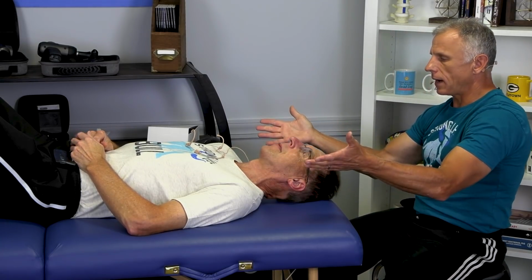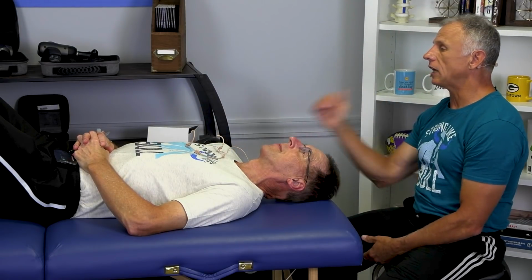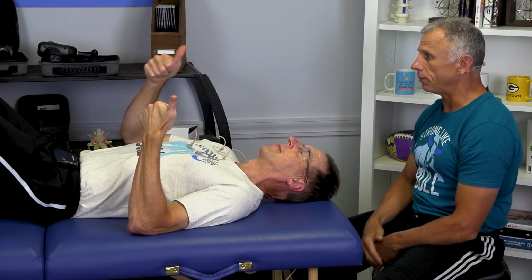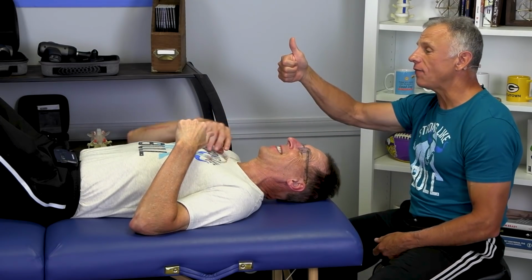Does it still feel good, Bob? Okay. Did the pain or the numbness feelings down your arm get better, worse, or the same? You can't talk now? Oh. Yeah, so he said it felt better.